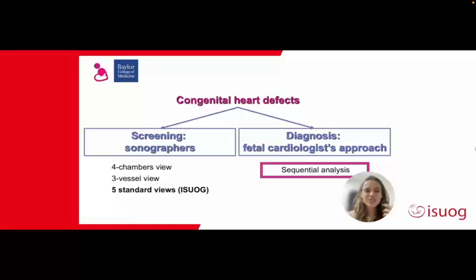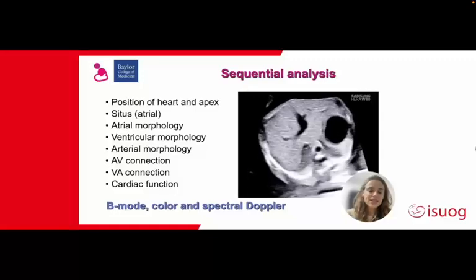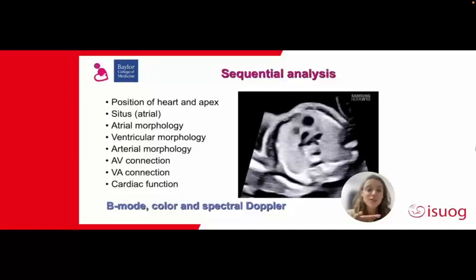Now, we've performed our screening, we suspect an anomaly, and we refer the patient for a fetal cardiologist's approach, which is this sequential analysis that I was talking about and I learned back in my time in London. Basically, it consists of looking at everything. So you start from the bottom of the heart to the very top.